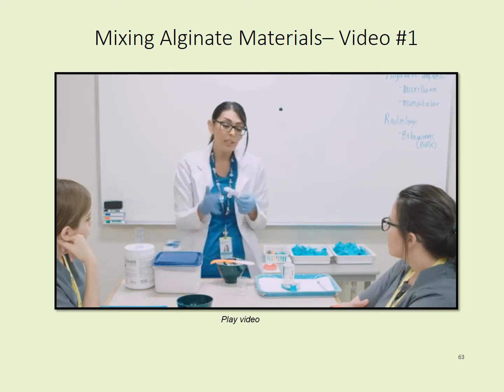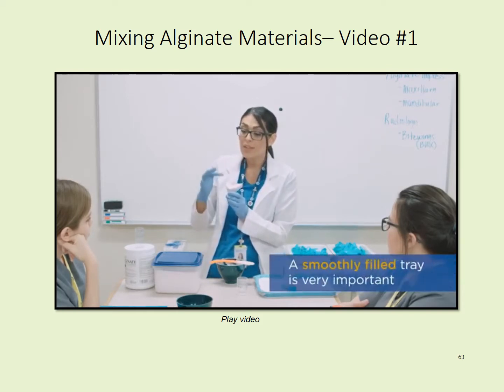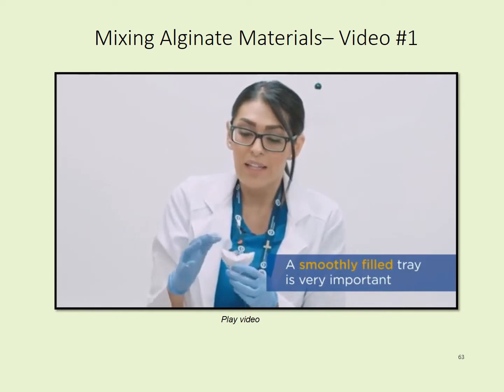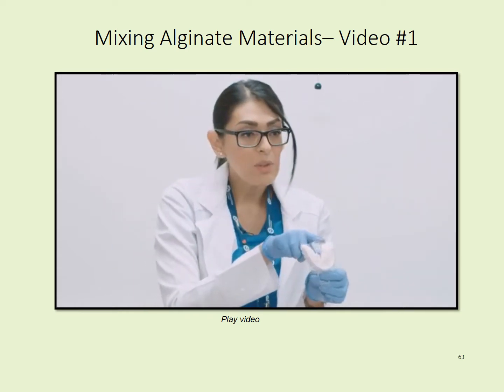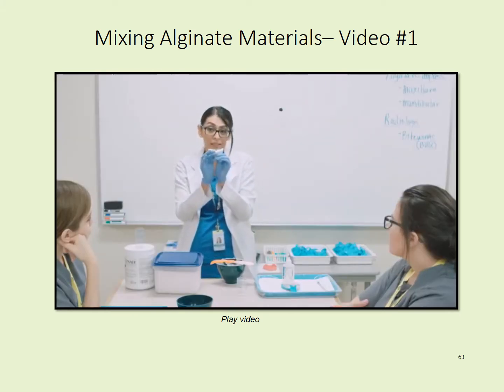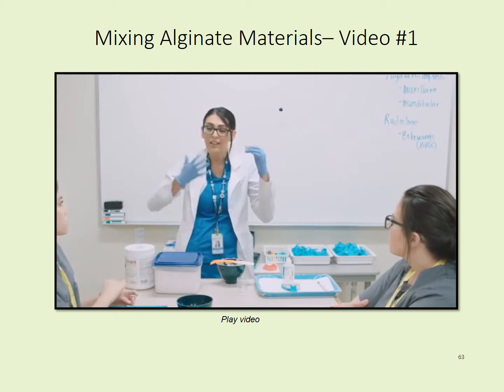So when you guys are placing the alginate impression inside the tray, it is very important that you have this nice consistency. I don't want a bunch of clumpiness, a bunch of dryness, and you can kind of see the difference of the two: this one is really, really smooth, and this one's kind of clumpy and dry. So if we don't have a smooth consistency and we place this in our patient's mouth, it's not going to correctly capture all the anatomy and the shape of the patient's tooth.